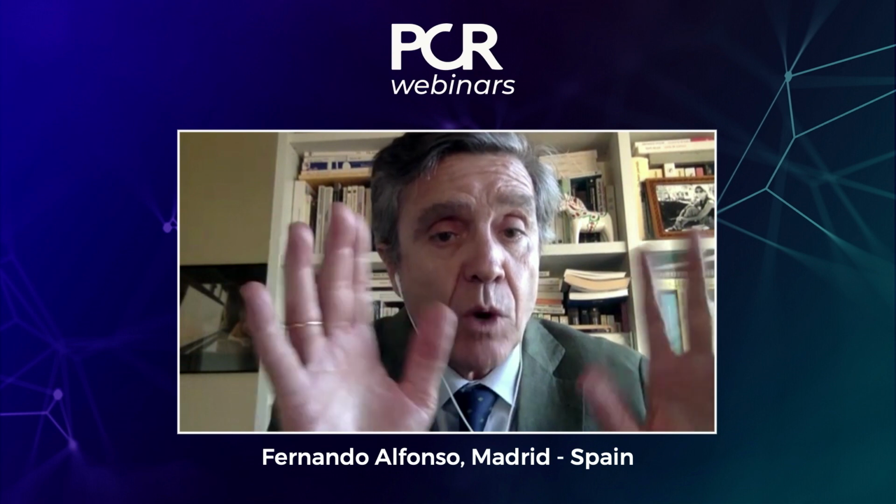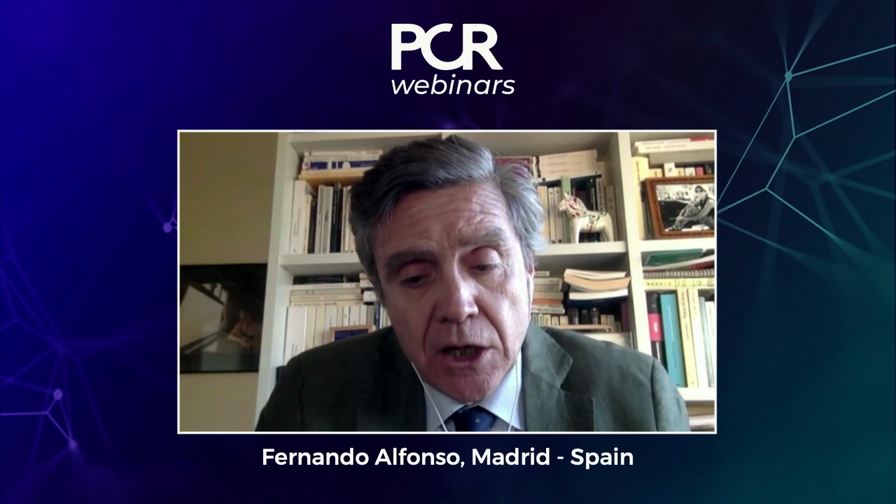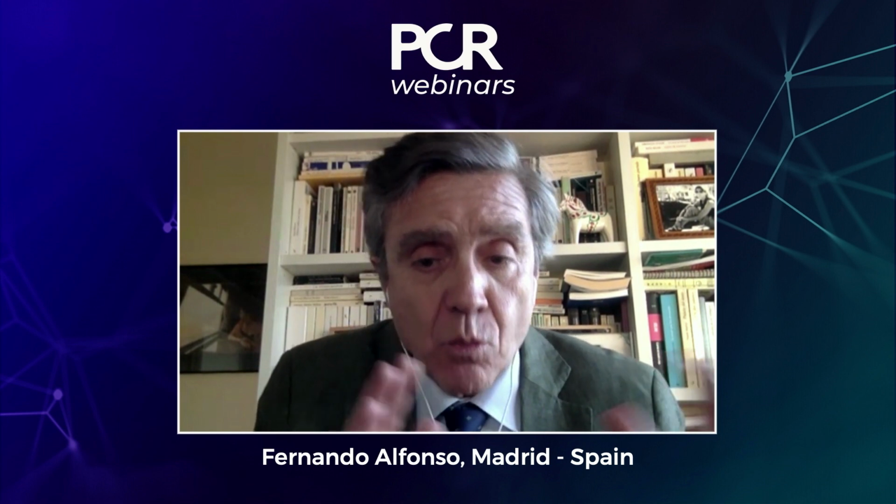Regarding acute MI, well, there is a study, as I told you, using FFR as a means to say, well, I don't care about the lumen diameter or whatever. I want to see what is the FFR in this patient with myocardial infarction. And this can be used. In my experience, this is with Tuchar from Madrid also, running some studies where at the beginning the use of drug-eluting stent in myocardial infarction were of concern because of a higher risk of thrombosis. This is the beginning. Well, there were some people using bare metal stent.